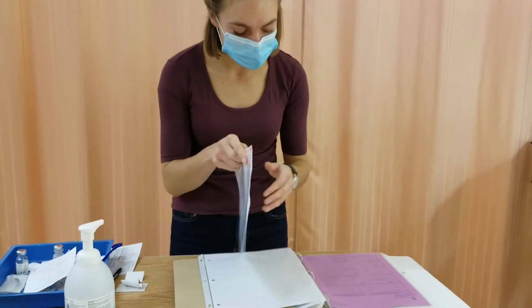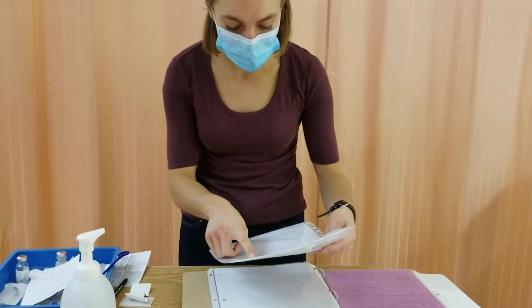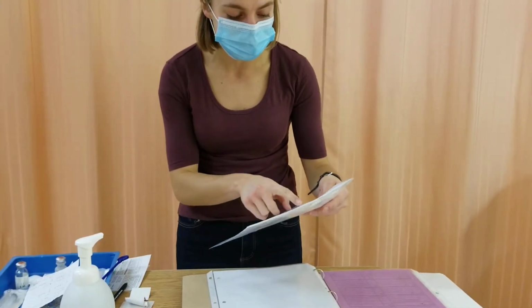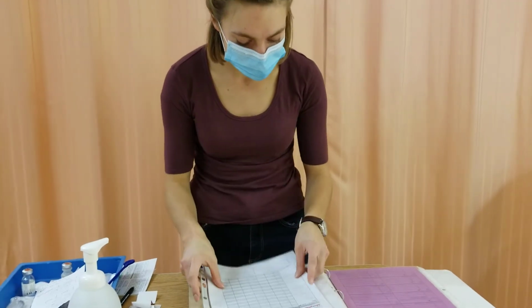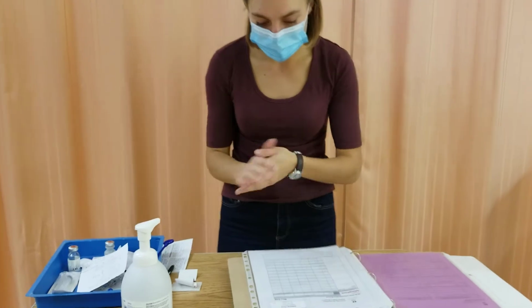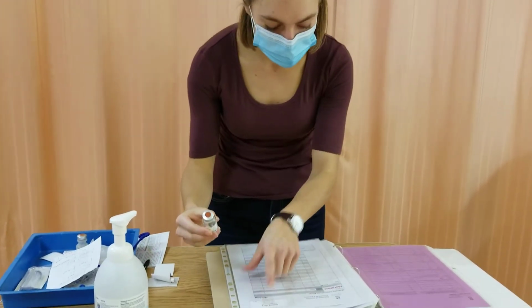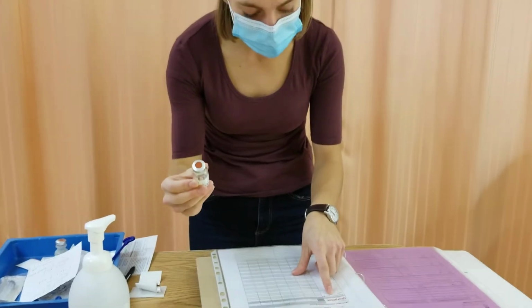And then I'm going to be doing some research, and I see that she has an increasingly warm red arm and she's been admitted with cellulitis. So the medication she's getting is Ampicillin, that's for her cellulitis. So first I'm going to wash my hands and get my medication. So for Dore Dabney, Ampicillin, 1 gram.